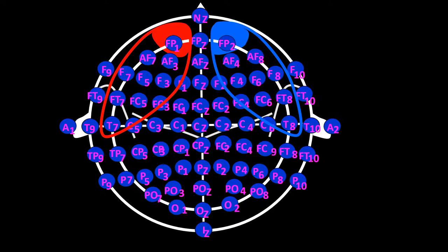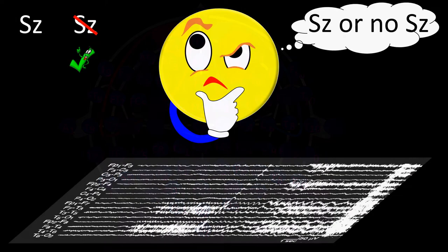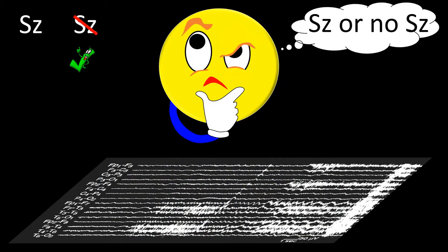We come to realize that the diagnosis of epileptiform activity is very unlikely based on the field distribution, because unlike epileptiform activity in which we usually have a single field, here we are seeing two fields. So we put one in the not seizure column, since very few events, as we have just previously mentioned, from a cerebral origin will have a horizontal dipole, and those that do have a horizontal dipole have a very different appearance.